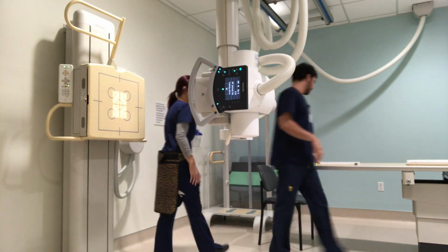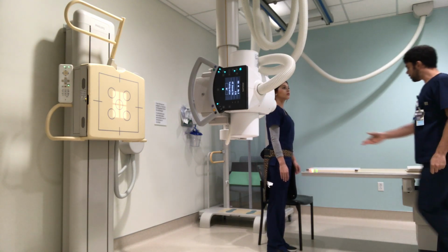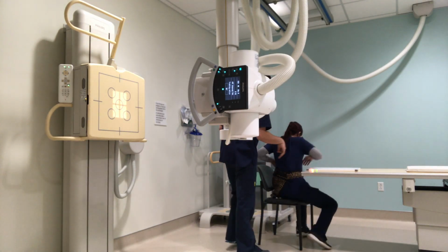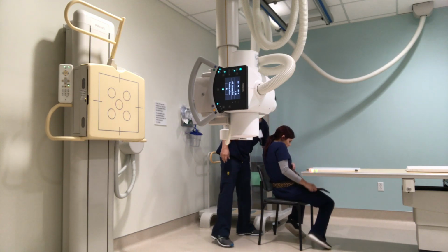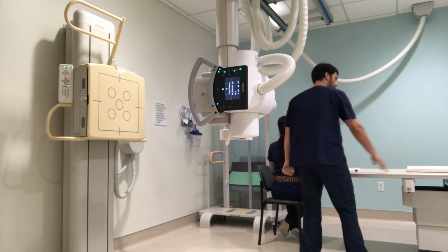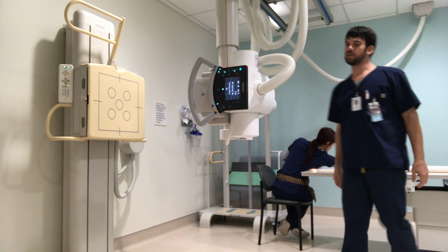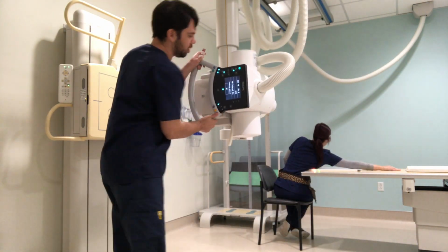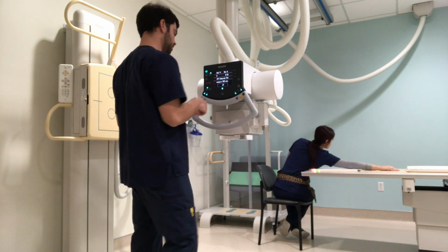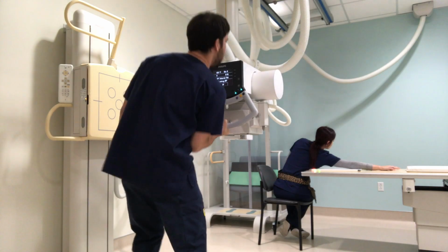And for the last one, we're going to do it right here on the table. So let me lower this for you. Can you sit down facing this way? We'll rotate the shield to protect your lap. Perfect. Okay, while facing this way, can you reach out as far as you can on this table? Palm down. That's perfect. For this one, make sure we set our tube back to tabletop, and then you've got to take it off of tracking as well. And now we're free to roam.